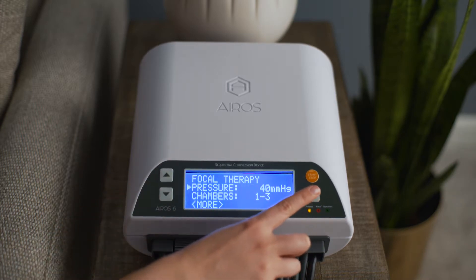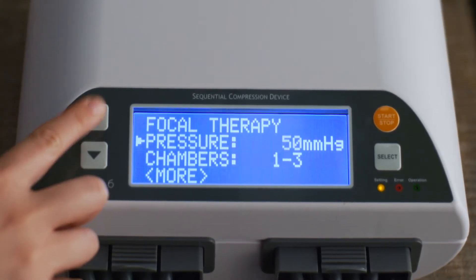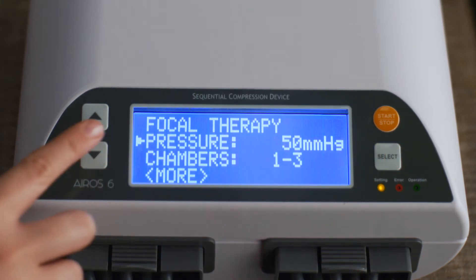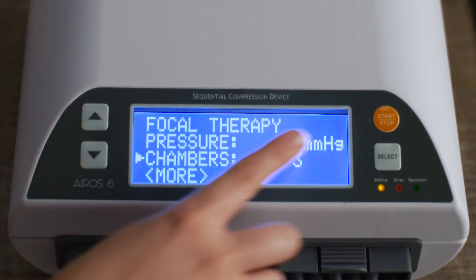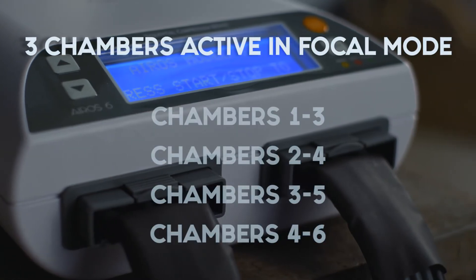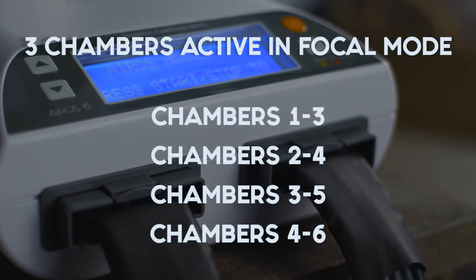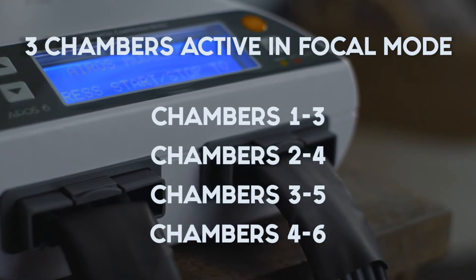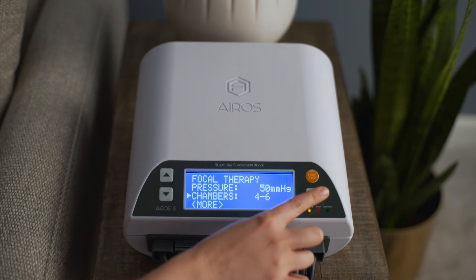To set the pressure, scroll to pressure and press the select button. You can use the up and down buttons to change the pressure. Press the select button to confirm your selection. To select the chambers to be active for focal mode therapy, scroll to chambers and press the select button. You can select to use focal mode therapy in chambers 1 through 3, 2 through 4, 3 through 5, or 4 through 6. Press the select button to confirm your selection.